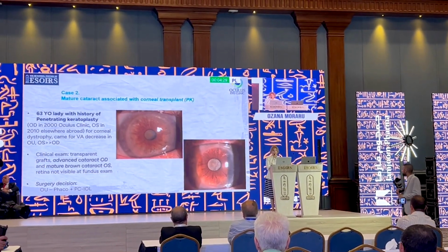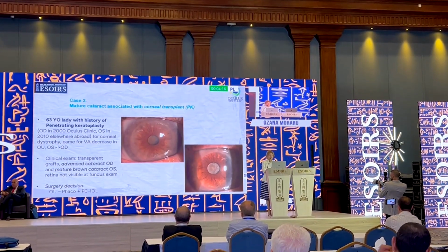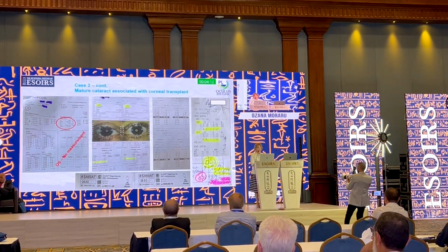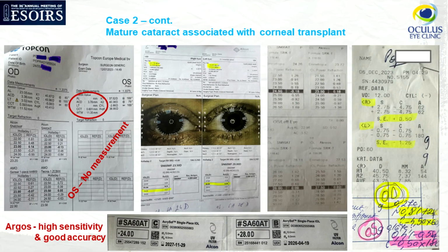But this is a quite interesting case, a lady with corneal graft, penetrating keratoplasty done 15 years ago. In both eyes she had mature and hypermature cataract, more than 20 years old or even more. And she came for cataract extraction. We performed again several machines for biometry. In the left eye where the cataract was indeed hypermature, Aladdin didn't measure at all, but we have a good measurement with Argos in both eyes, 24 respectively 28 diopters.